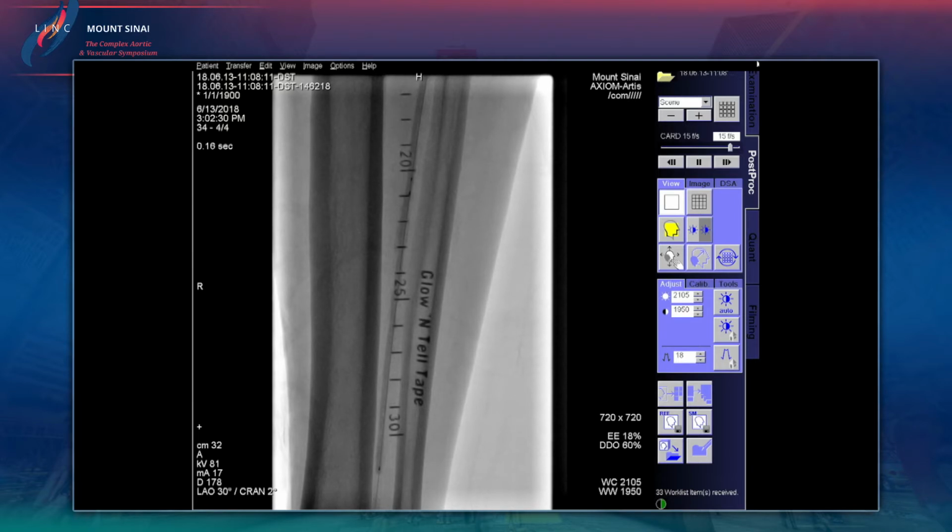As you can see, I balloon a little bit longer than most. The other question is in terms of antiplatelet therapy for these patients. Do you believe in increasing the antiplatelets? I know the guidelines say 30 days for peripheral intervention, and obviously for drug-eluting stents and balloons it's a little bit different. But say you're just doing a balloon angioplasty without a drug-coated stent or a drug-coated balloon. Do you increase the duration of antiplatelets?